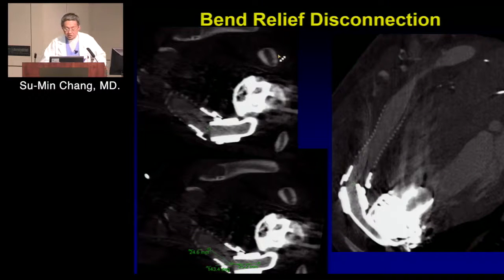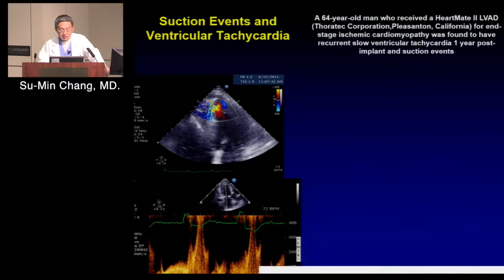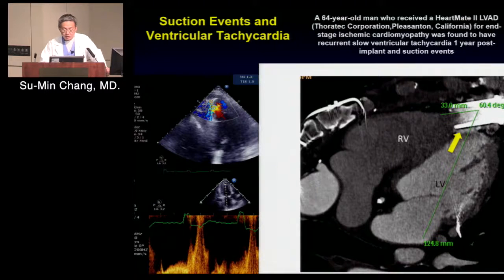So one thing you need to look at is the integrity of the different components. This is one of the patients who had the bend relief disconnection. Obviously the patient is still alive, so there's still a casing outside holding the whole thing together. But chest X-ray can show you as well. Obviously with CT you can look at more detail. So this is one thing that you can look at.